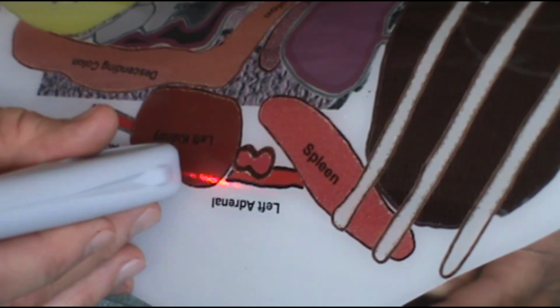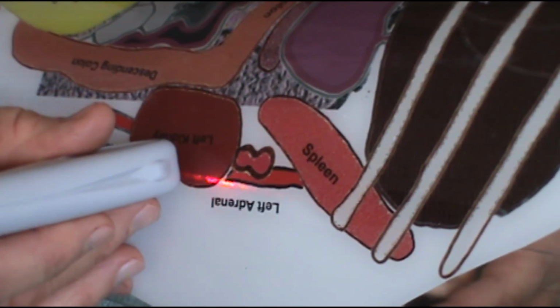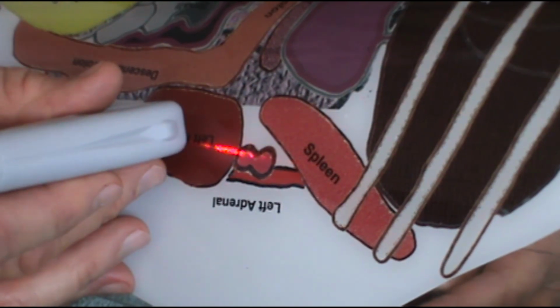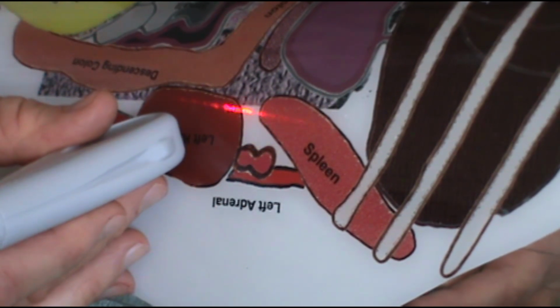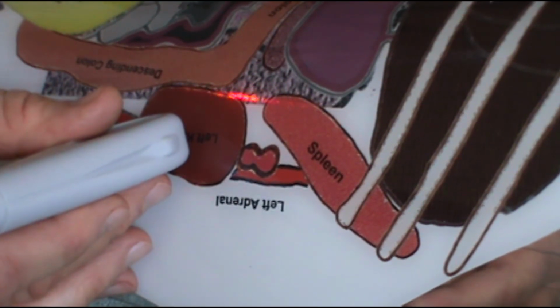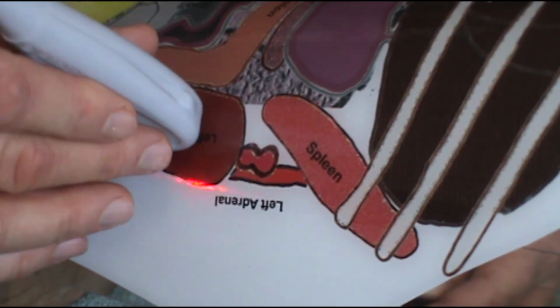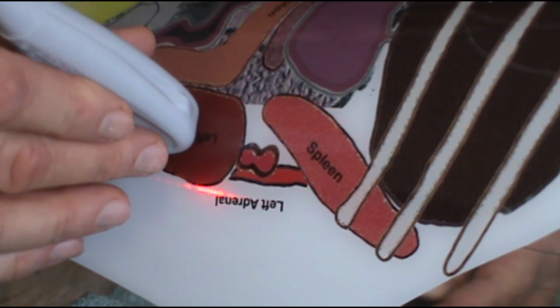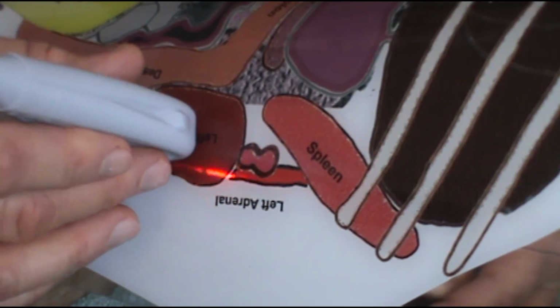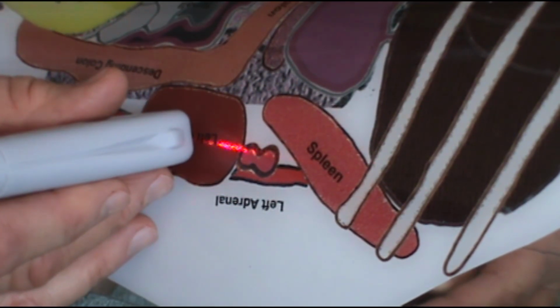Slide the transducer slightly dorsally or ventrally to center the kidney under the transducer. Fan the transducer ventrally until the ultrasound beam is no longer within the kidney. Then reverse directions and fan dorsally until the ultrasound beam is no longer within the kidney. Return to the initial position bisecting the kidney.